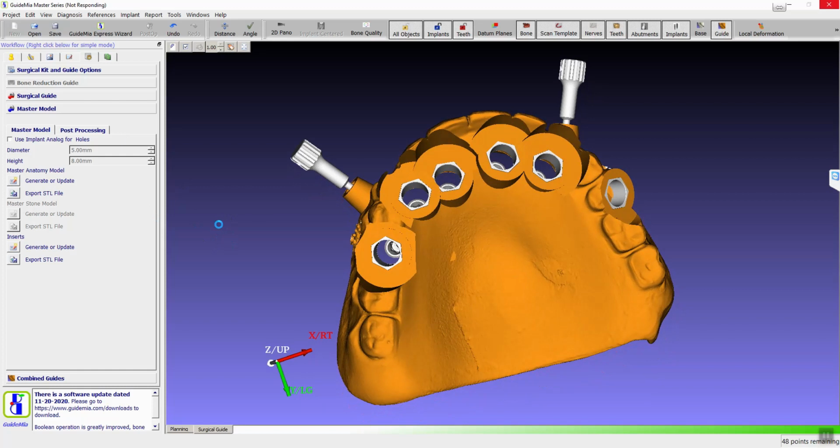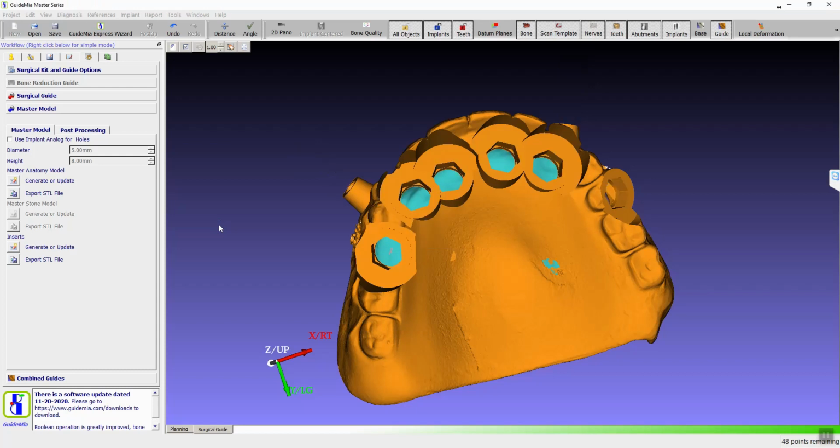So for Chrome guides, the major good thing is you have a good restoration reference, right? When you do the cutting. That's what we really would love to see. Well, if you want that, I would definitely work on that. That's not a problem.